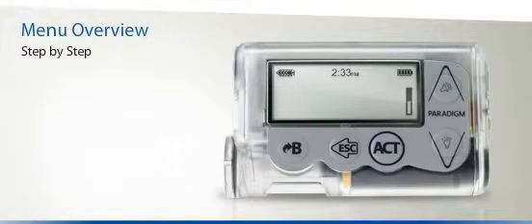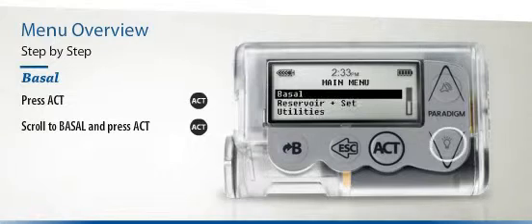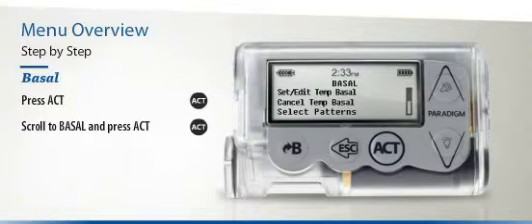Let's look at a few examples of how you can find the features and functions you are looking for. First, how do you access the Basal menu? You can begin by pressing the Act button once, then scroll to Basal and press the Act button again. You will now see the Basal menu.